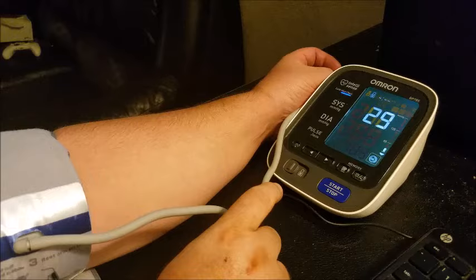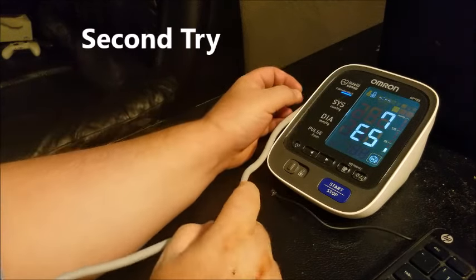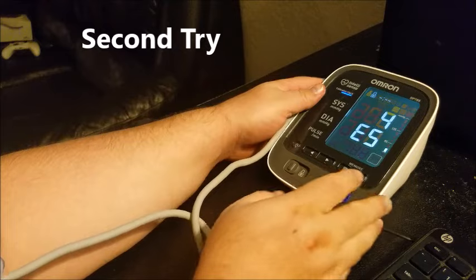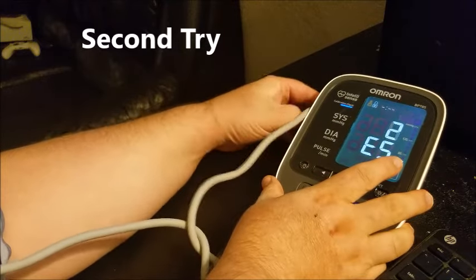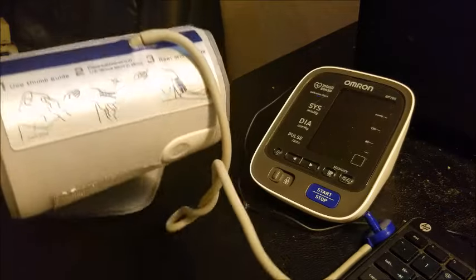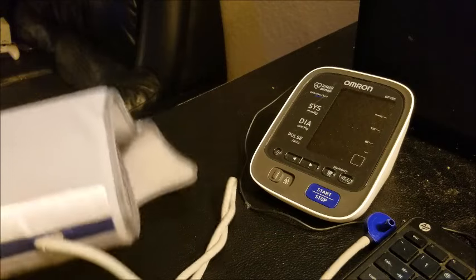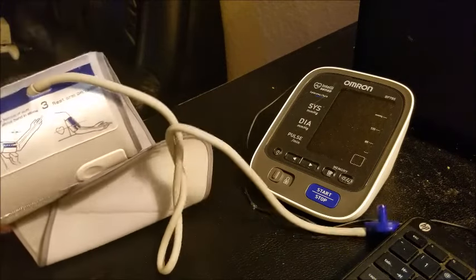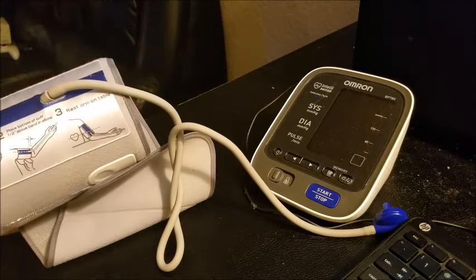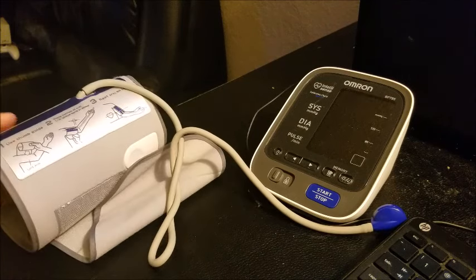Now I'm getting an E5 error. So what you want to do when you get these errors, regardless of what number of error it is — I'll show you at the end of this video the different types of errors. Some are for overpressure, like ER-1 is for inflation error, ER-2 is for deflation. I'll show you all these errors at the end.